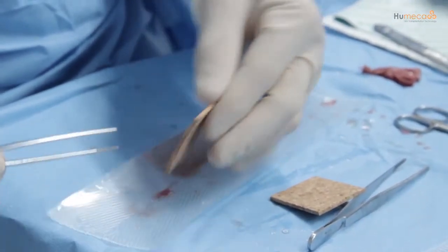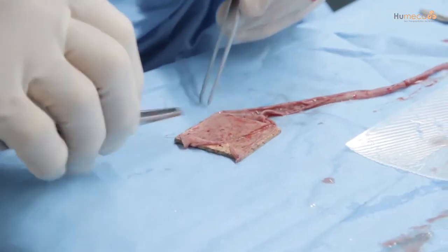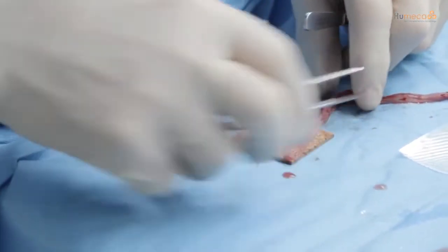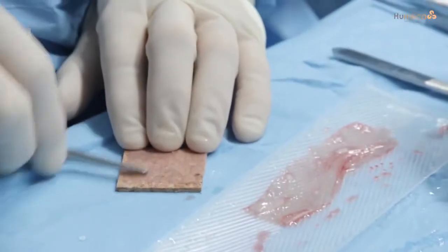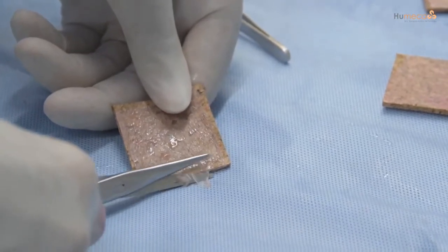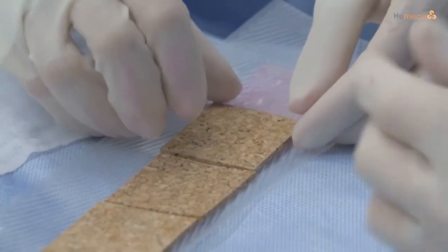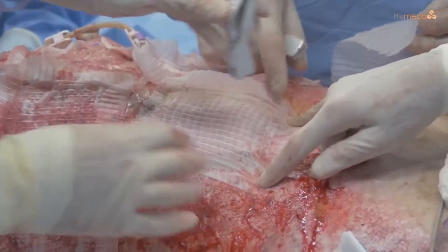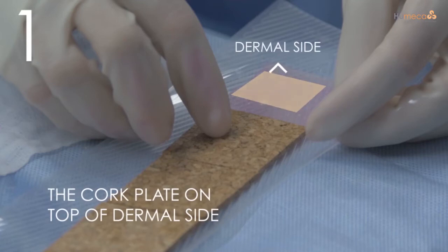After cutting, gently turn over the cork plate so the skin is in place and flat. An alternative is to place the graft dermal side down directly on the cork plate, then trim the graft to the exact size of the cork plate. Otherwise excess skin will not be part of the cutting process, resulting in a lack of skin islands in that row. Always make sure the dermal side is against the cork so you will end up placing the skin islands dermal side down on the wound bed.